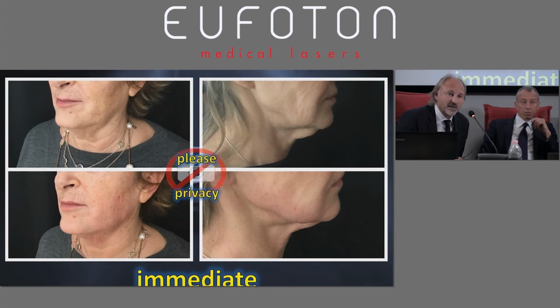And the fibers, it's not necessary to change them. It's not necessary.